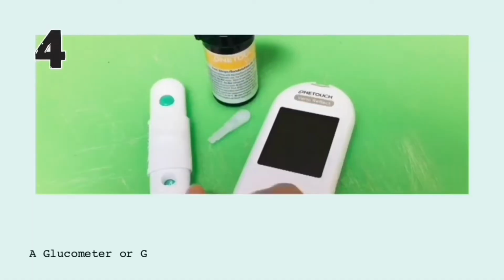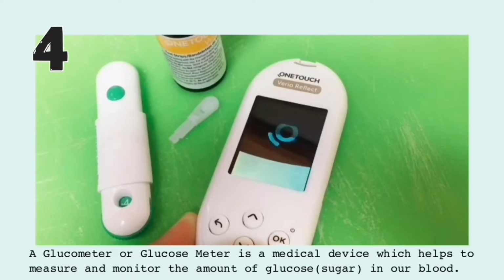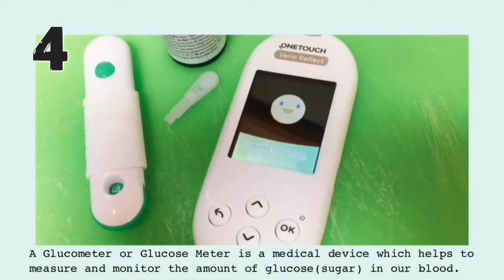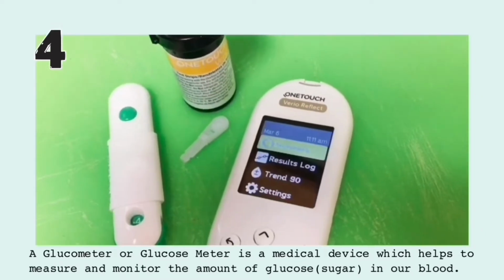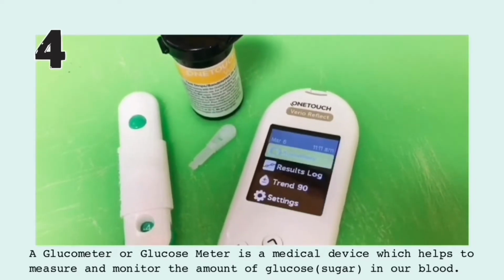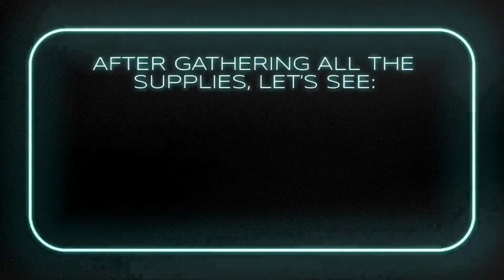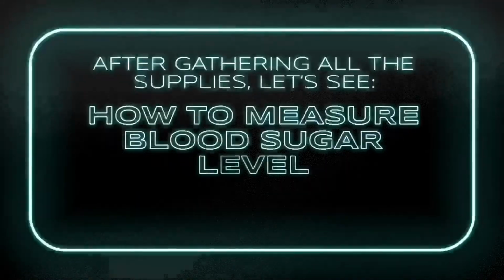And the last thing we're gonna need is glucometer. Glucometer or glucose meter is a medical device which helps to measure and monitor the amount of glucose, that is sugar, in our blood. So after gathering all these supplies, let's see how to measure blood sugar level step by step.